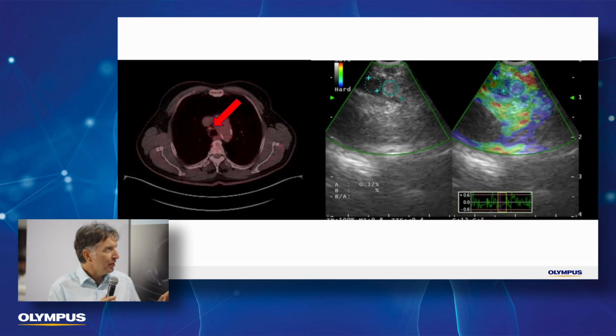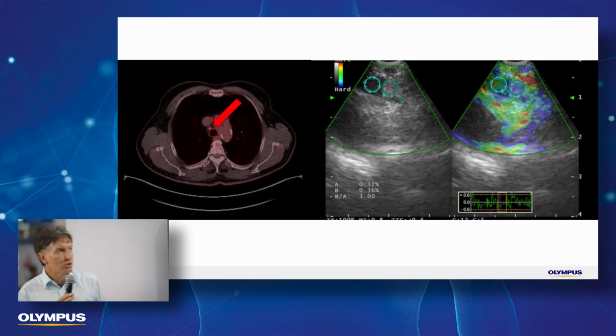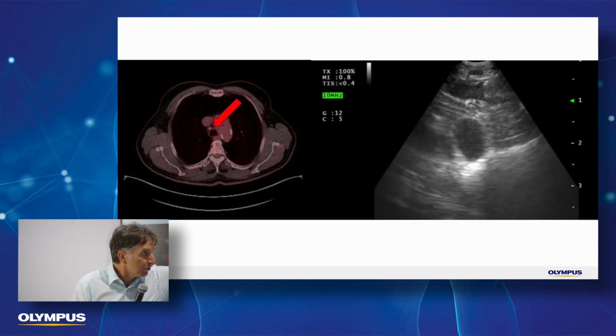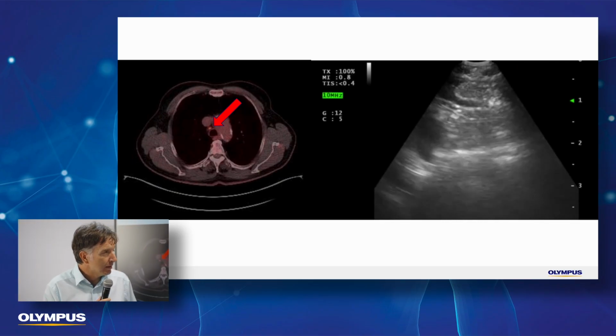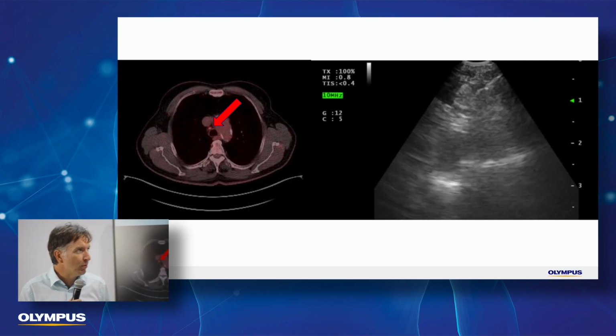It's a waste of time to take a biopsy from this side of the lymph node, which appears pretty normal, but we identified this target within the target, and we take a sample just from this small ball, and we actually get a benign result. The pathologist says it looks like a granuloma, but from cytology he's not sure, and he said, okay, it's a little bit atypical.